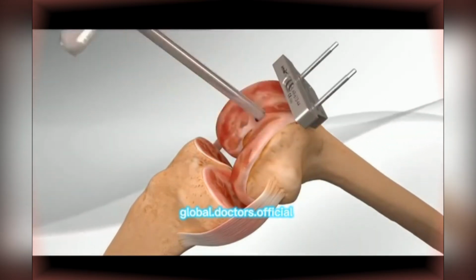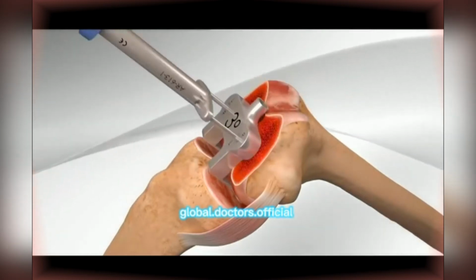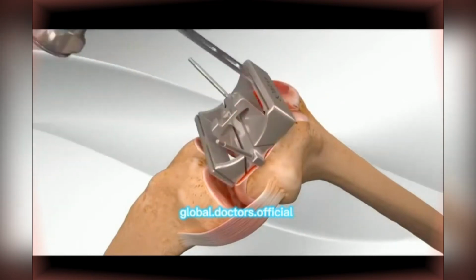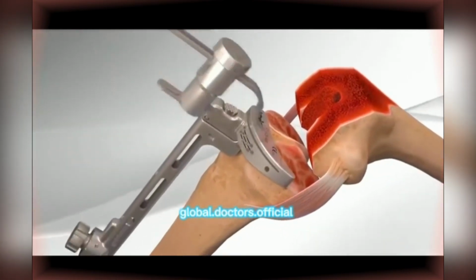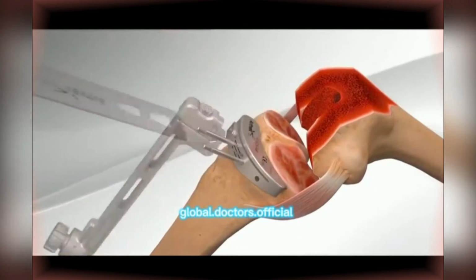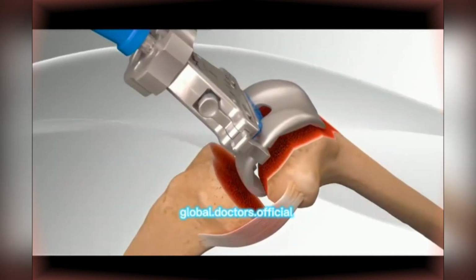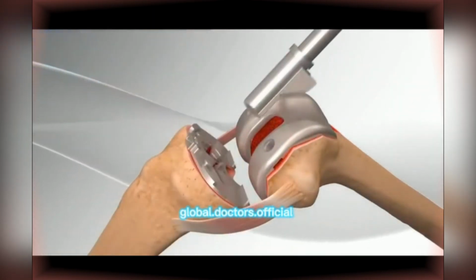During the surgery, your doctor uses a series of guides to help remove the damaged bone and prepare the femur, ensuring proper implant size and alignment. Next, your doctor will prepare the tibia using a series of guides to ensure proper implant size and alignment. The final tibia preparation is completed and a trial spacer is used to confirm knee stability.